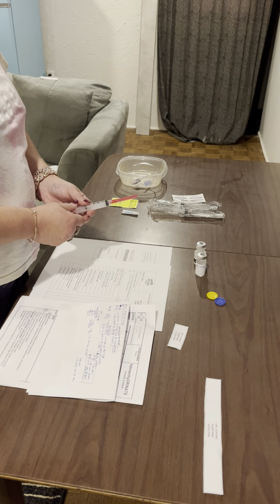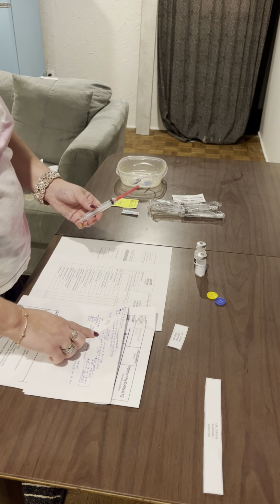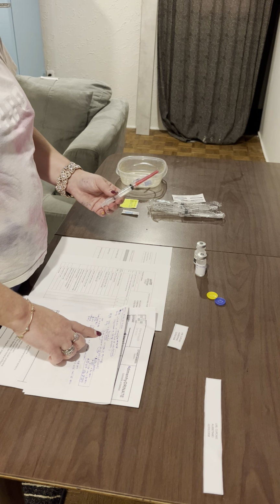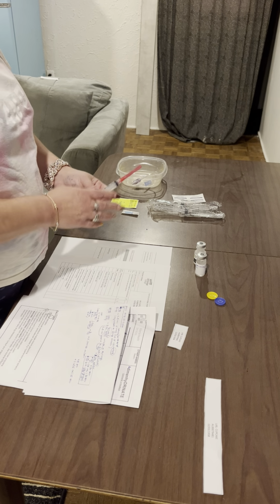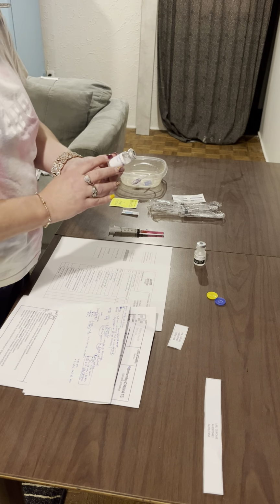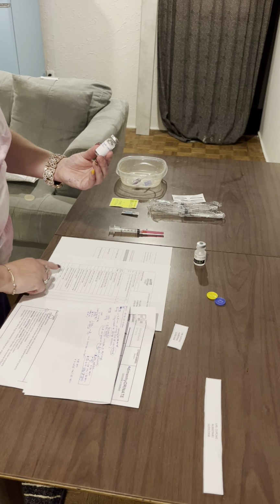Okay, so the next thing that we're going to do is concentrate on our medication. According to our med math, we want 0.5 mils of medication. So the next thing we're going to do is draw up air in 0.5 mils. Again, I'm double checking to make sure this is dimenhydrinate, 50 milligrams per mil.